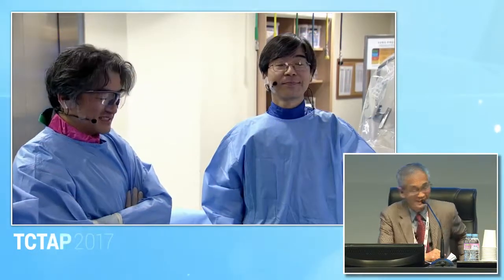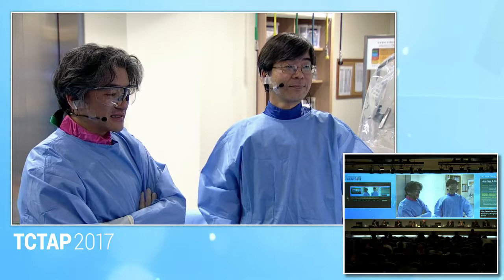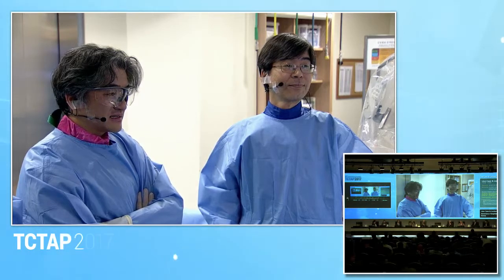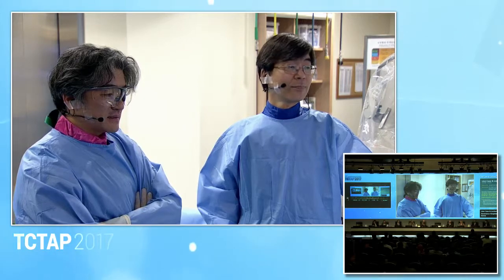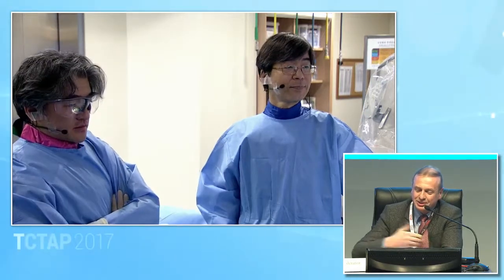May I ask you, you said you do PCI only because she has two major surgeries, but on a regular basis, if she did not, would you definitely send such patients to surgery? Is there any option or opinion from you about that? No, this is my question to you.